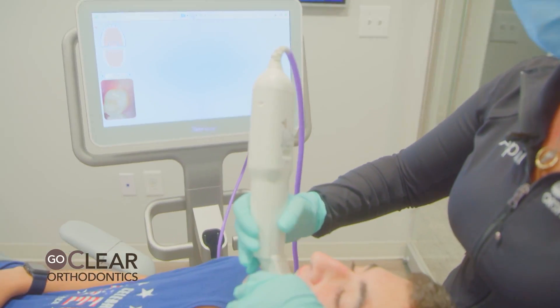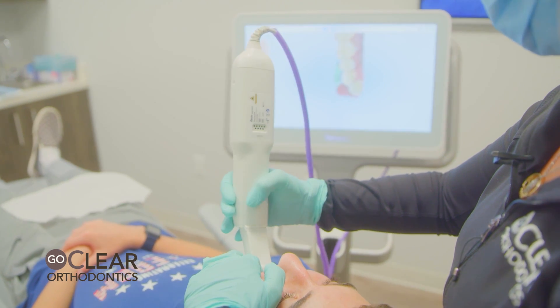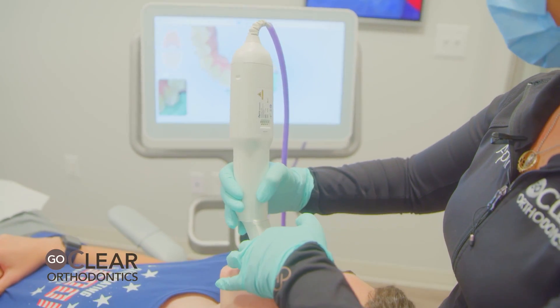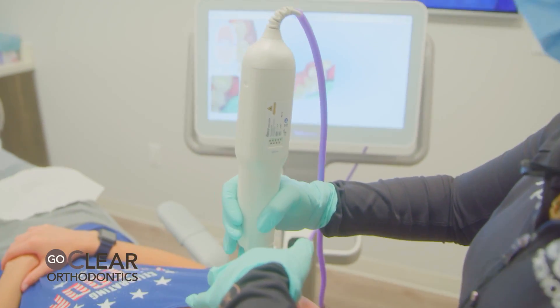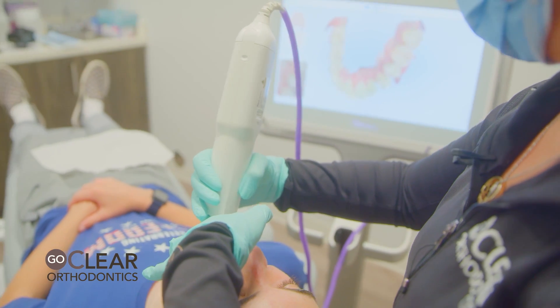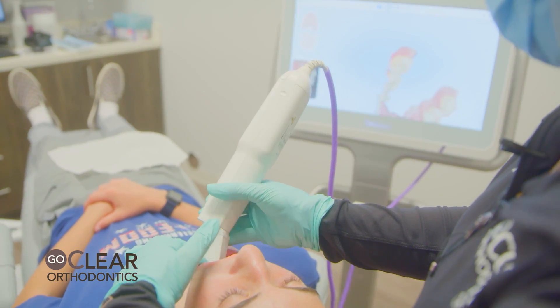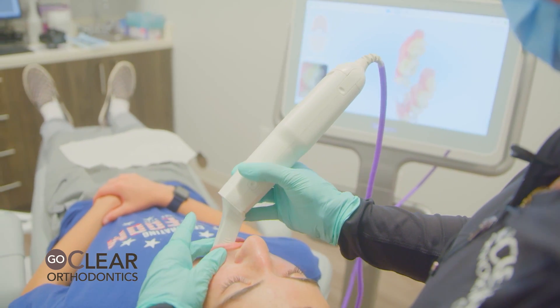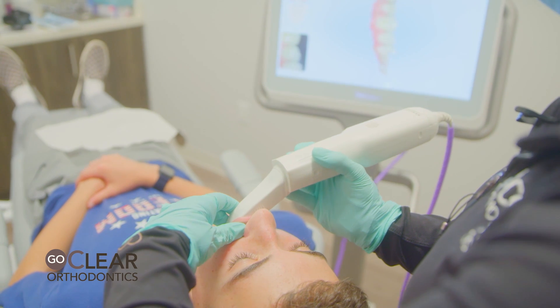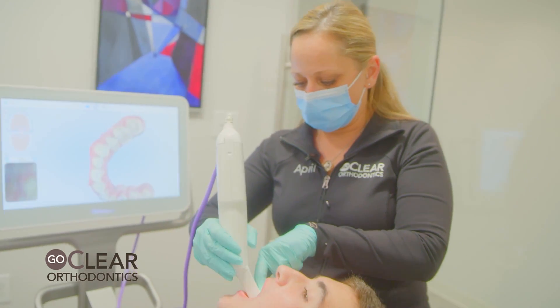Upper left, around to the upper right — occlusal surface, up to the canine. Tilt the base towards his chin, straight across the lingual for upper anterior. There's the canine. Straighten your wand base straight back to the second molar. Roll in towards the lingual and go all the way back to the left. The more you turn this, the more tooth you're going to get. Now we're going to roll back to the buccal and work our way to the midline. See how I'm holding his cheek and lip? If not, it's going to slip out of my fingers and cause me to have to go back multiple times to fill in.